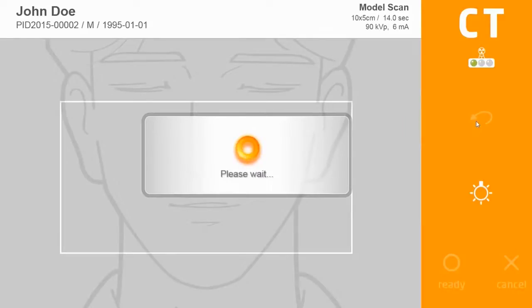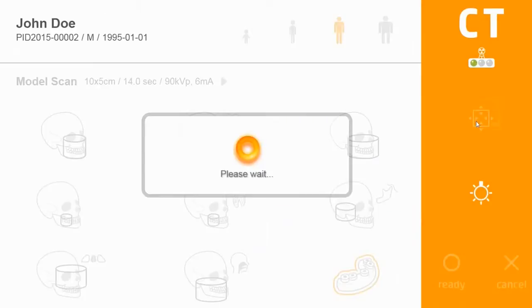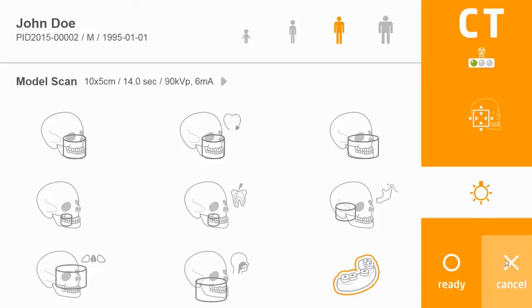You can also turn the positioning lasers on and off. You can ready the unit or cancel out of this interface. Once you have made the desired selections, click Ready to acquire the CT image.